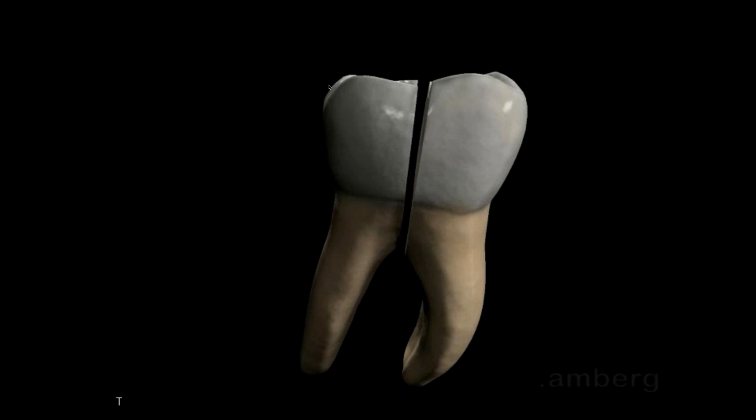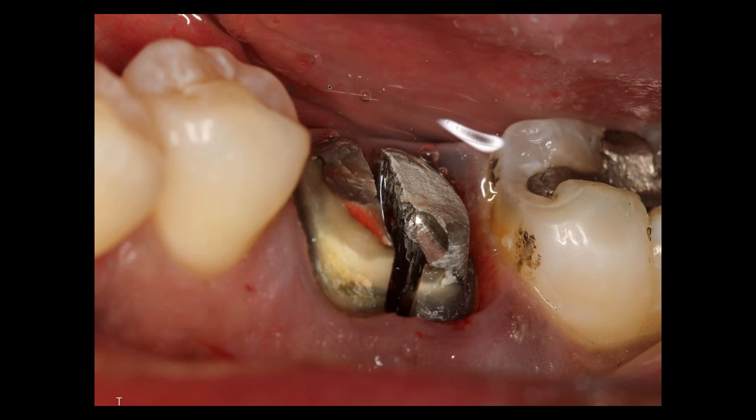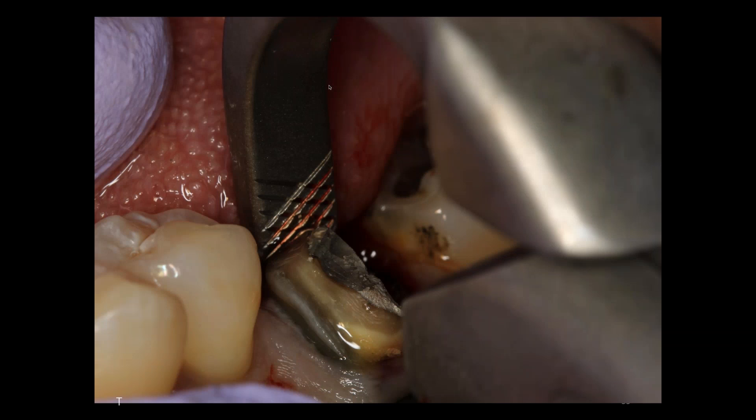Here I'm using the universal mandibular forcep. I'm engaging the lingual aspect one to three millimeters subgingival, placing the bumper as deep into the vestibule as possible and simply rotating my wrist.